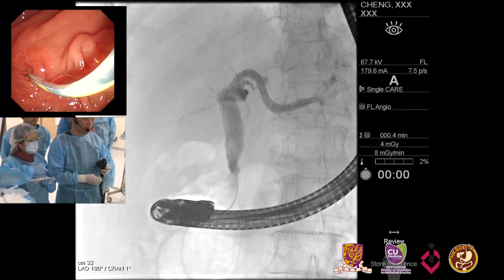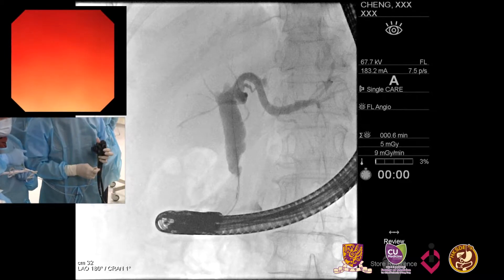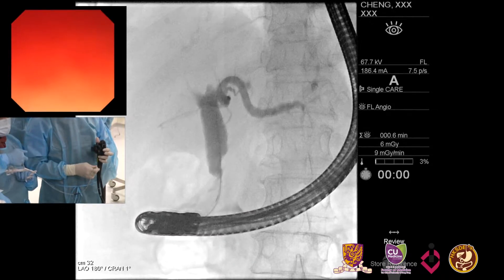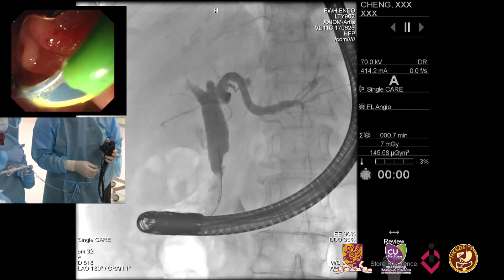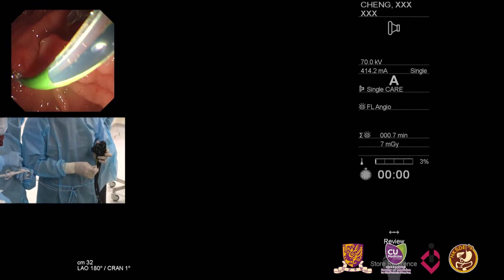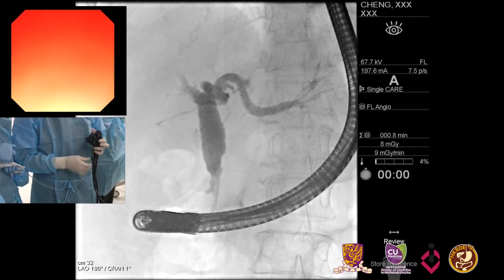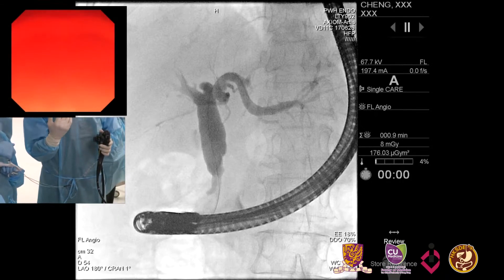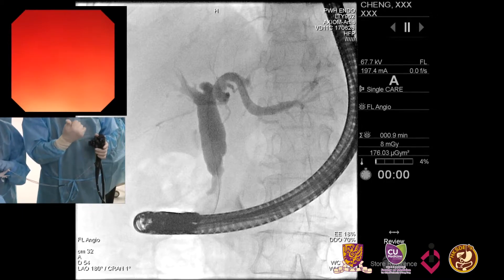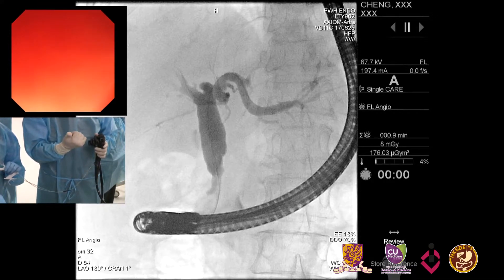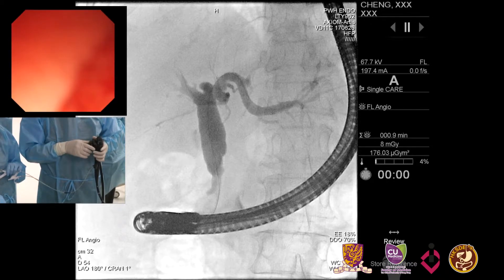As you can see on the cholangiogram, there's proximal ductal dilation. In the distal part, there's somewhat irregular stenosis towards the end. This patient never had a cholecystectomy — the cystic duct appears to come off from the mid-extrahepatic bile duct. We should rotate the C-arm to see exactly where the cystic duct takeoff is, because we're considering whether to go for multiple plastic stent placement or a fully covered metal stent for at least three to six months to exert a more robust dilation effect.